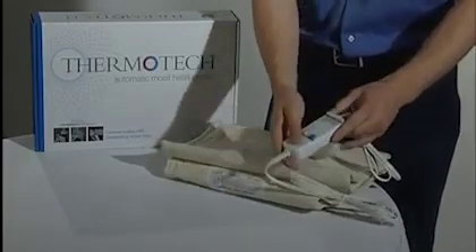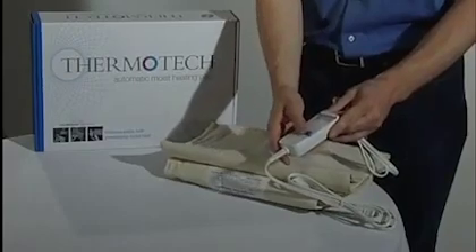The Thermotech comes with a digital control set or an analog control set. The digital allows you to either run a program or set a desired intensity level. 113, 130, 150, and 166 degrees Fahrenheit are all capable settings.